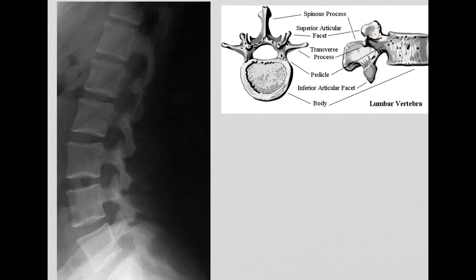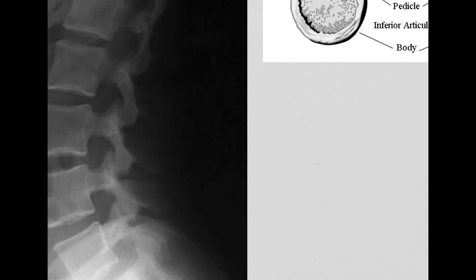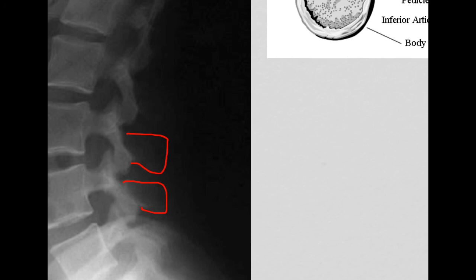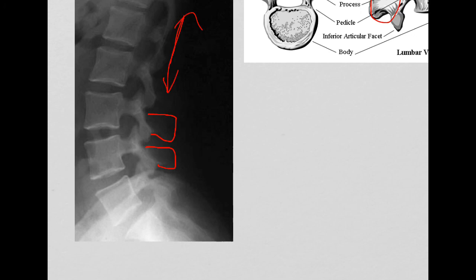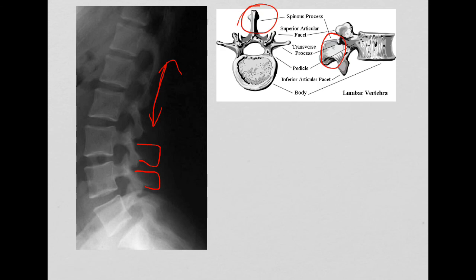Remember that on the lumbar vertebra, our spinous processes here and here are very blunt. They're not long and skinny like they were on our thoracic vertebrae. If I zoom in you'll see a little bit of that spinous process here and here. Keep in mind you are not going to see the transverse processes on the lateral view.